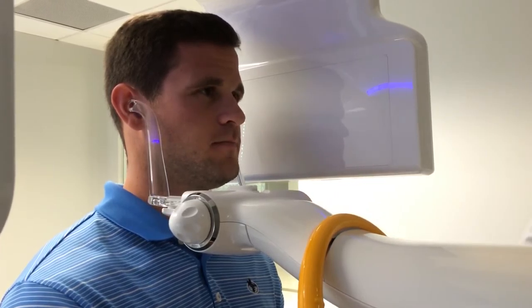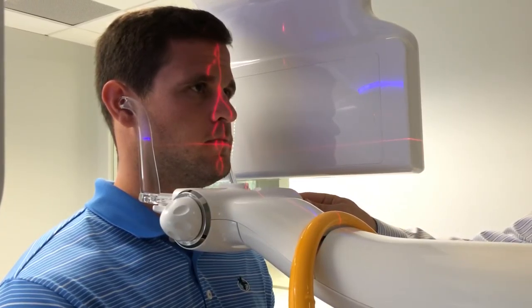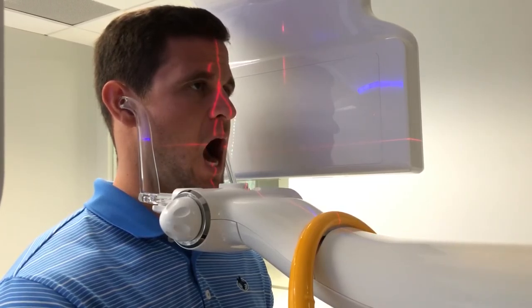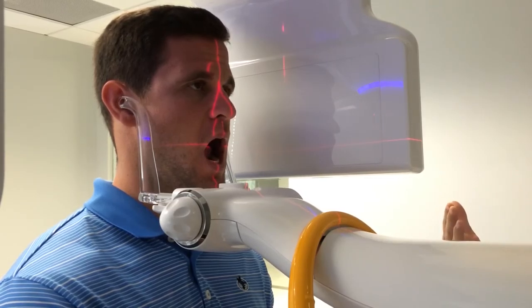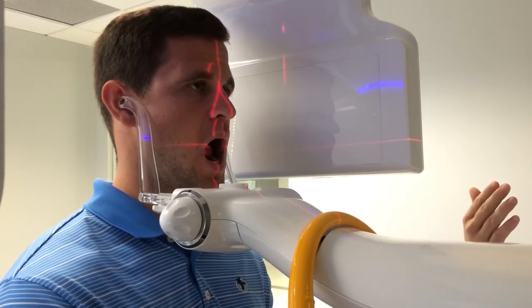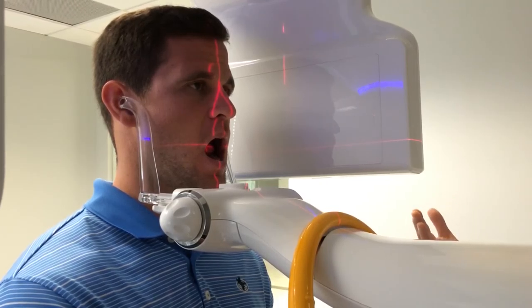Yes. I'm going to turn our positioning laser on just to make sure our mid-sagittal plane laser is accurate. Once we have that lined up, I'll instruct the patient to open his mouth fully so that for the first pass around the patient, it will take an image of both the right and left joint with the patient's mouth open. It will complete the rotation, and then I'm going to instruct the patient to close his mouth for the second rotation, so that we have the open and closed joints next to each other in the final image.